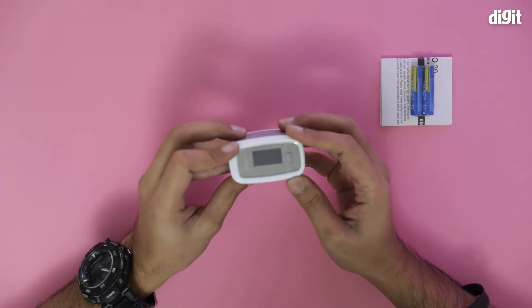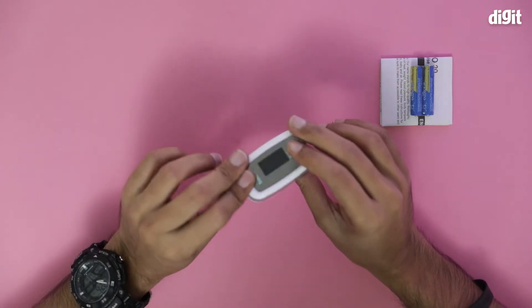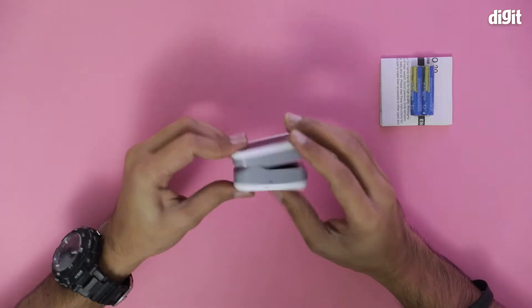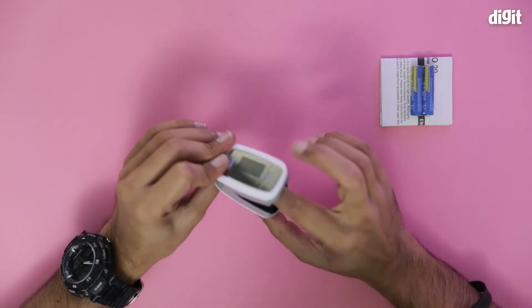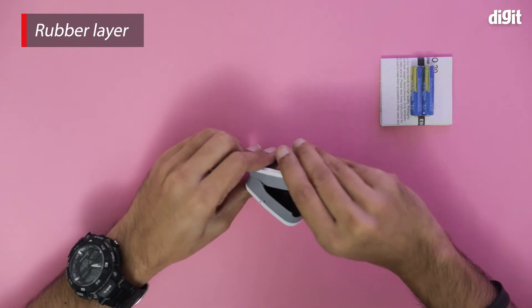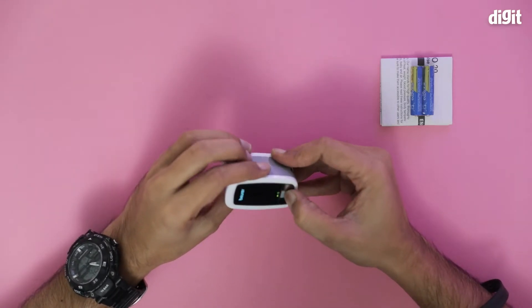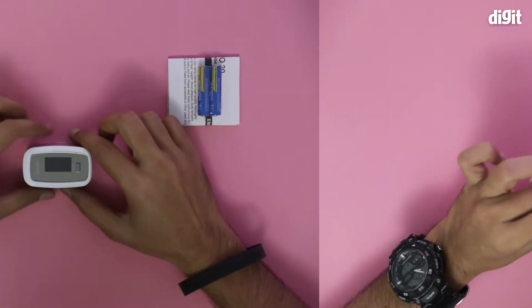It has a bit of a sleek design form factor going on — there's a shiny bit here. It's much larger than most of the other oximeters that we have seen. There is a rubber surface inside, which is new — you don't usually get that. The LED screen is also pretty large.